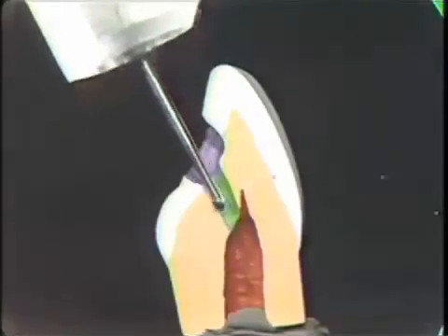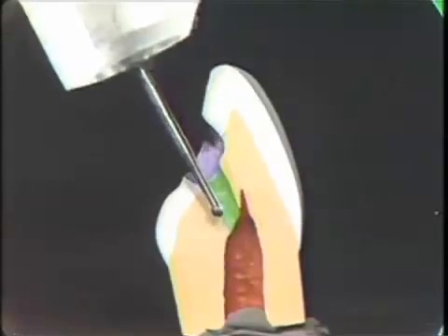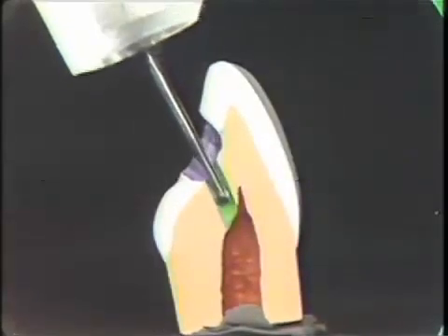Now, if you really get lost and you feel like you just don't know where the pulp is or what the angulation of the tooth is, you may want to stop and take a radiograph. Now, here you can see that someone has gone the wrong direction twice. He didn't realize the angulation, the long axis of the tooth, so he stopped, took a radiograph, then he can reorient his burr to the long axis of the tooth and go directly on down.